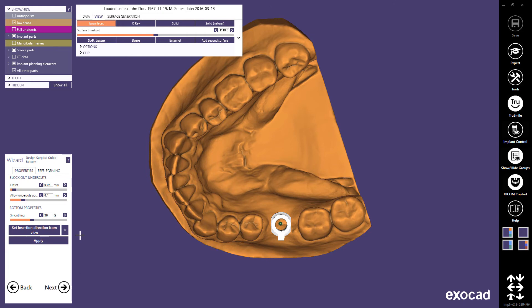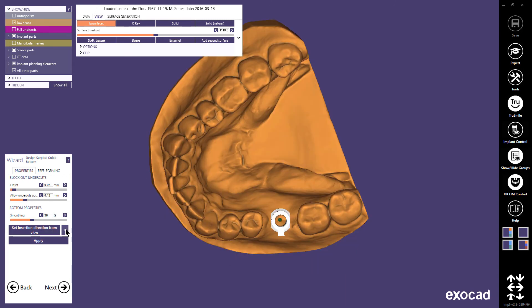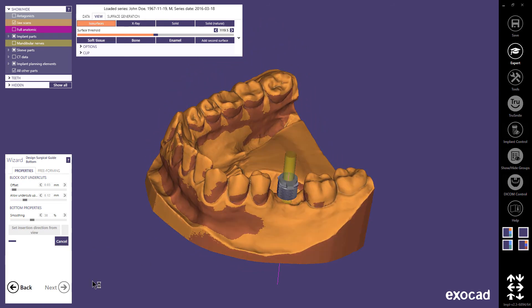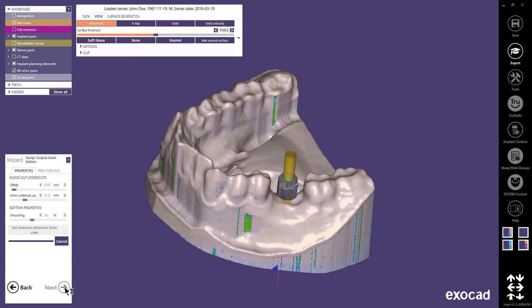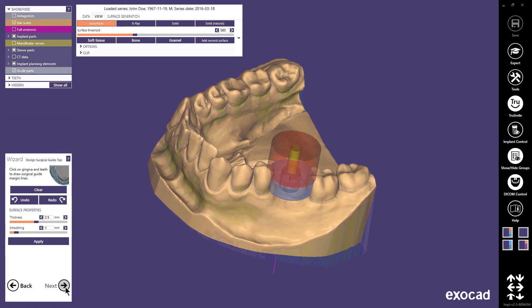Now it is time to create the surgical guide bottom. With the sliders, you can define the offset between the stone model and the guide, and you can decide how much undercut you want to allow. I set the insertion direction from view with the corresponding button and apply it. The darker areas on the model will be blocked out. When the bottom has been generated, you can use the free-forming tools to fine-tune the design if you want. Continue with Next.